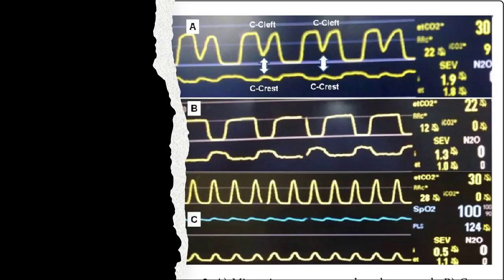Here's another example. So let's see what we have here. This is your End-Tidal CO2. And then here's your airflow monitoring. So you see the bump combined with the cleft, and this is patients breathing fairly rapidly, right? Now understand that there might be a case where this is expected, like with pressure support, and you want them to have some respiratory effort. So some clinical context is important.